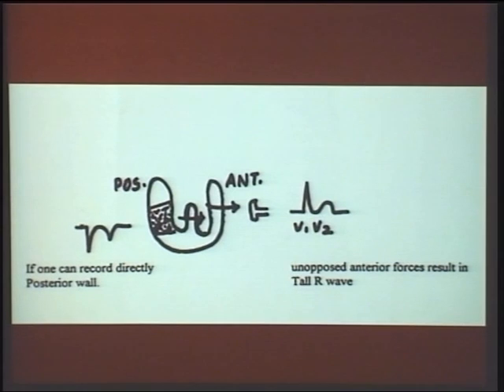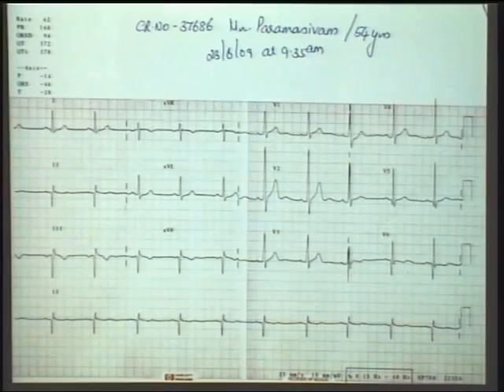In addition to inferior wall infarction, you have posterior wall infarction, because this R wave in V1 represents the Q wave in the posterior region. Right? So that is the importance of looking beyond what is obvious. Like in this ECG, you can see what is the diagnosis here. What is a single sentence diagnosis here?